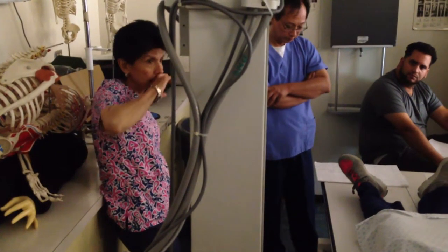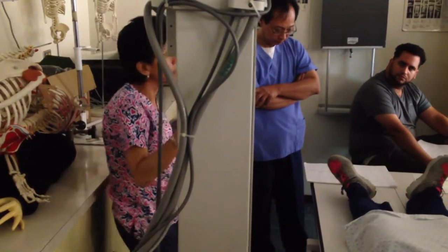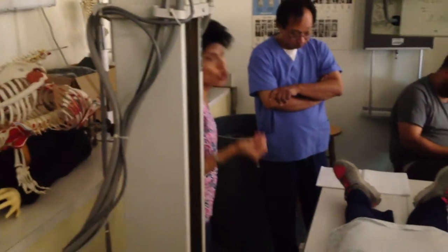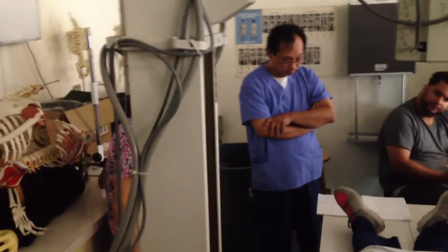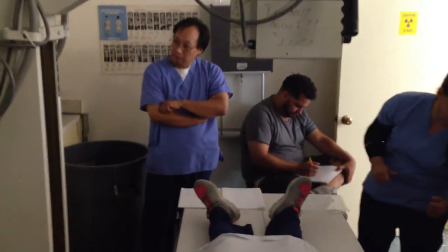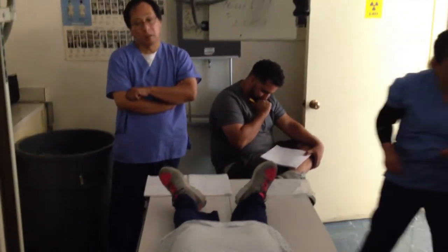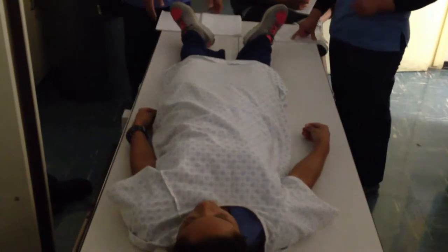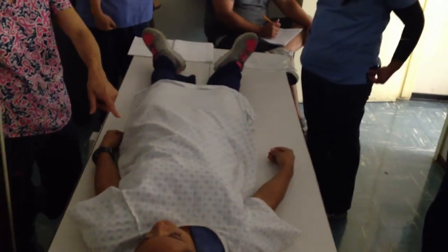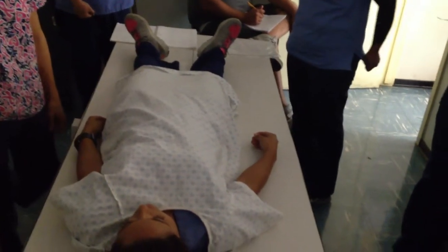Questions on this? So this is our AP. Our next view should be what? RAO, right lateral, or LPO — which one should it be? Right lateral, then the RAO. Why not LPO? It depends on the last position of the patient, but since this was their first overhead, right lateral makes sense — it would be more comfortable.